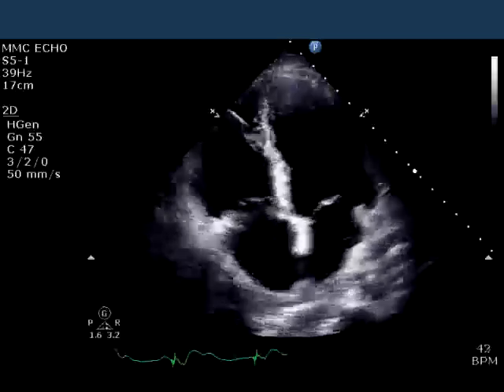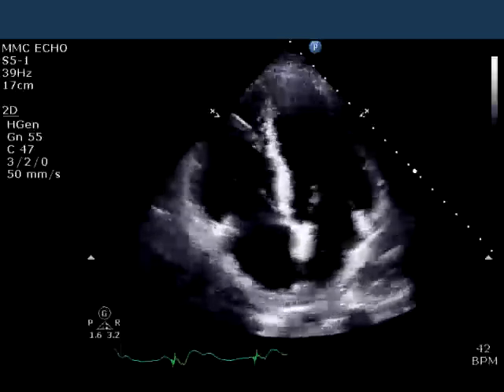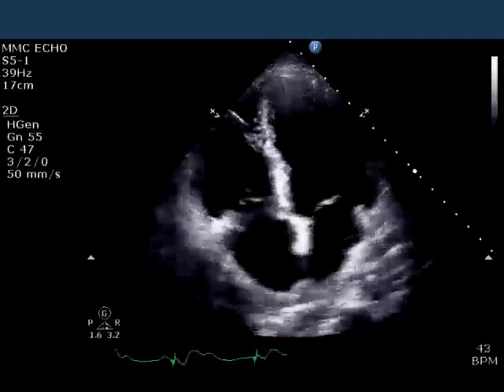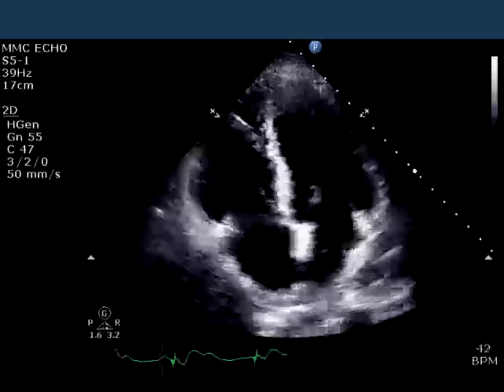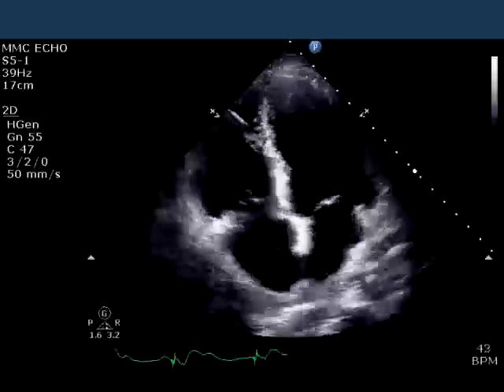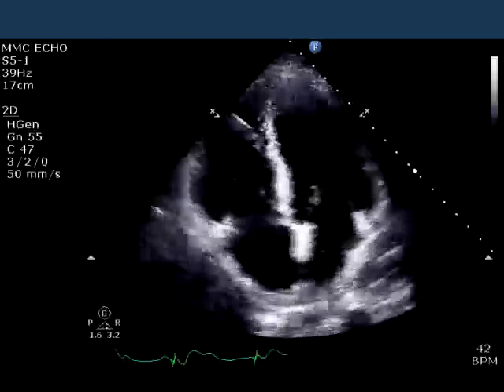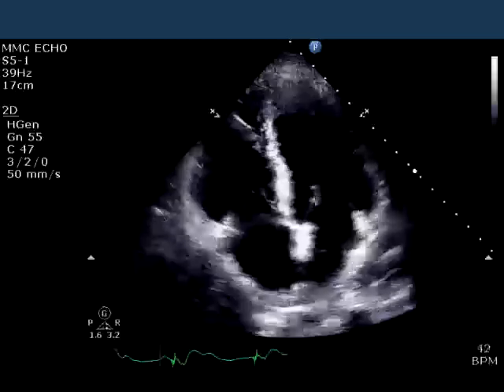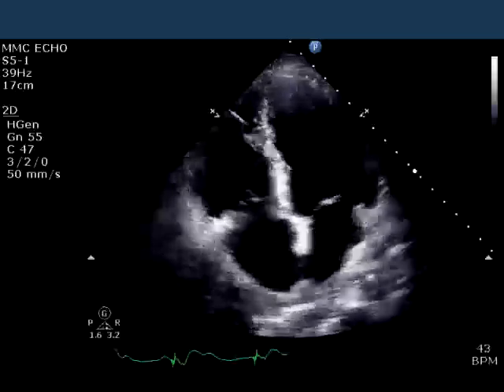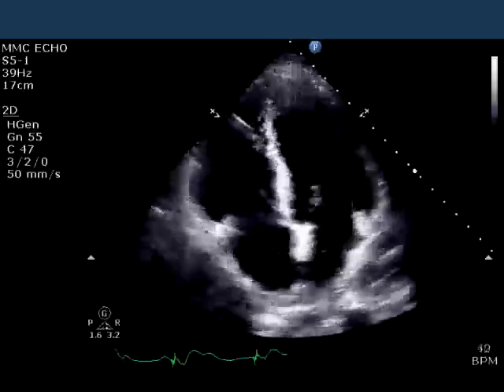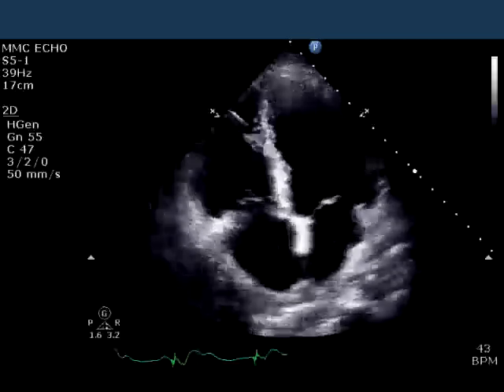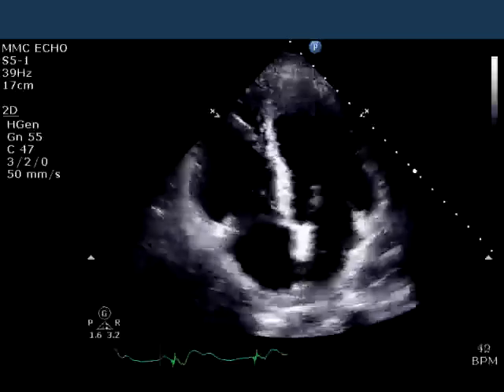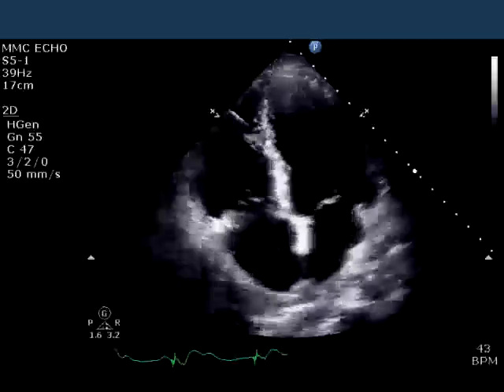This is an apical four-chamber view, and you can see the lateral wall is thickening well. The septum seems to be somewhat hypokinetic; parts of it are akinetic. The right ventricle is very dilated and very hypokinetic, and if you look very carefully, you can see a very bright signal towards the right ventricular apex.